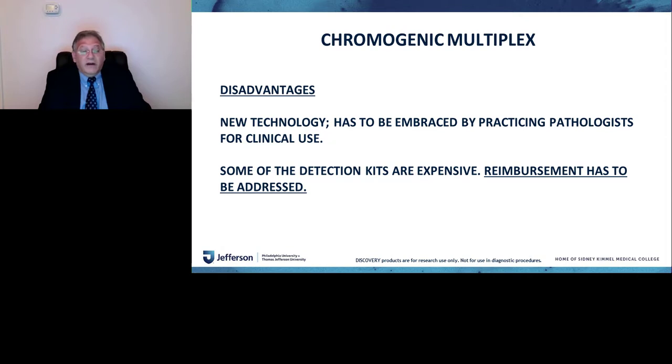Regarding the research components, in addition to immunofluorescence, which was basically the only way you could do multiplexing, nowadays you can also have a chromogenic multiplex. Still, at this point, we have a limited number of colors, only 5, 6, 7 colors. But I'm sure that with image analysis, new technologies, and new methodologies for using the chromogenic and light microscope, things are going to change in the near future.